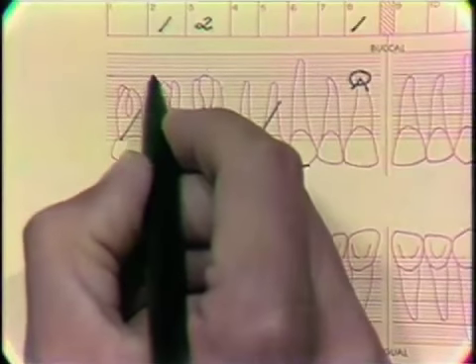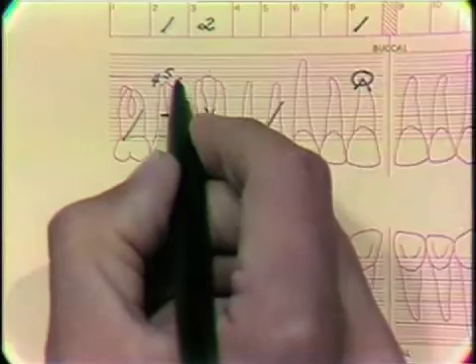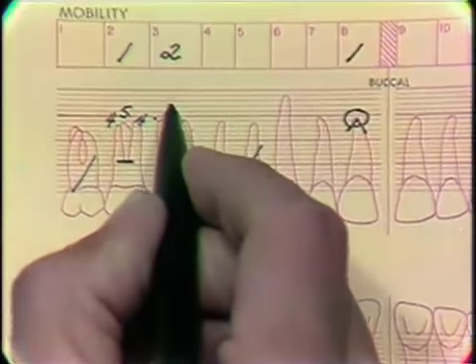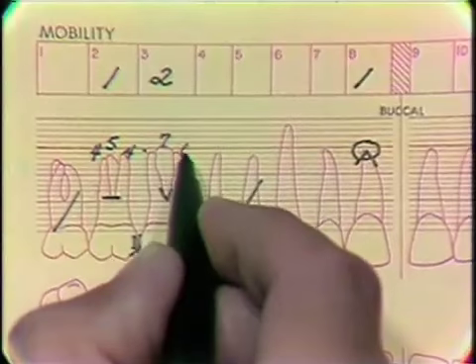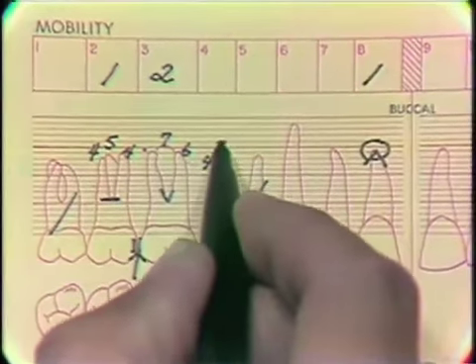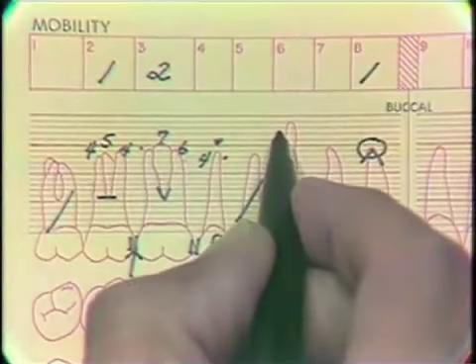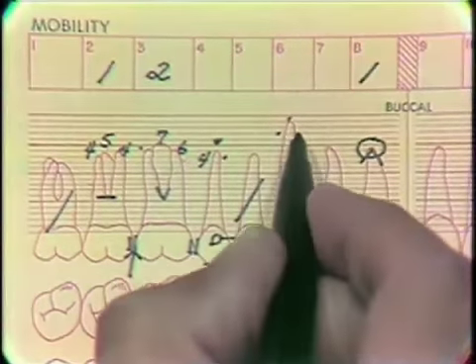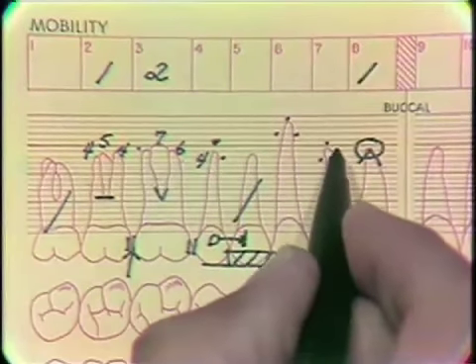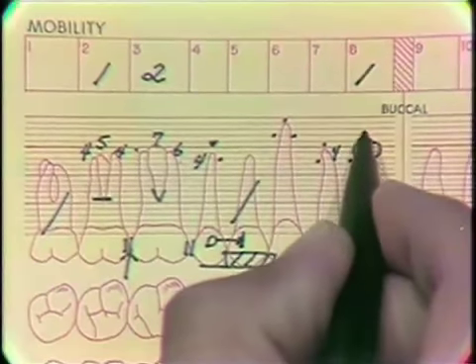4, 5, 4, 3, 7, 6, 4, 3, 3, 3, 2, 3, 3, 3, 4, 3, 2, 3.